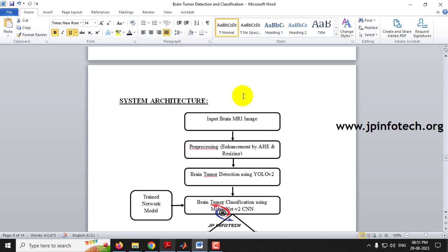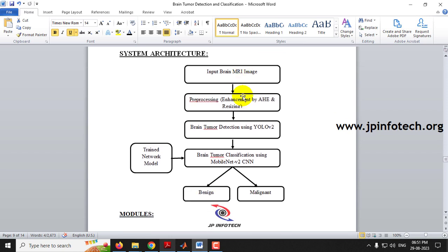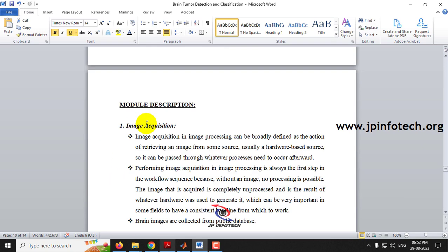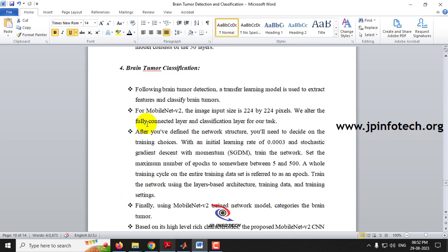The system architecture takes a brain MRI image as input, then pre-processing is done through image enhancement and resizing. Brain tumor detection is performed using YOLOv2, followed by brain tumor classification using MobileNetV2 CNN, which classifies the tumor as either benign or malignant based on the trained network model.